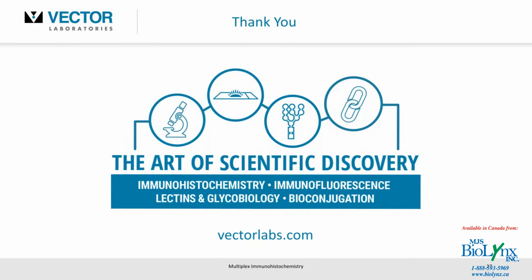I think it's an extension of single label light microscopy. So there'd also be ease of application, whereas immunofluorescence might take a little longer to work up and optimize too. So I think there are some significant advantages in using chromogenic multiplex. I'm not going to say that one is better than the other. It depends on your application, as I indicated too, with the CD3 and the CD8. It depends on the application and the scope of the project. Archiving might not be important to you, but nonetheless, hopefully that gives you some insight into some of the advantages of using the chromogen-based systems.